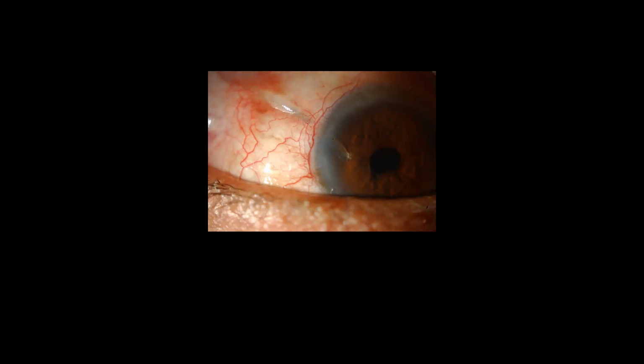Continue, please, doctor. So now slit lamp examination, including first we have to rule out a leak and also look for discharge. Look for signs of infection, like we will see exactly if there is pus in the tube or pus around the tube and the exposed area. Excellent. In the AC, we will look for AC cells, any hypopyon, any KPs.